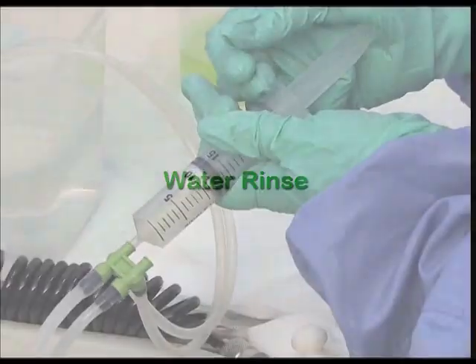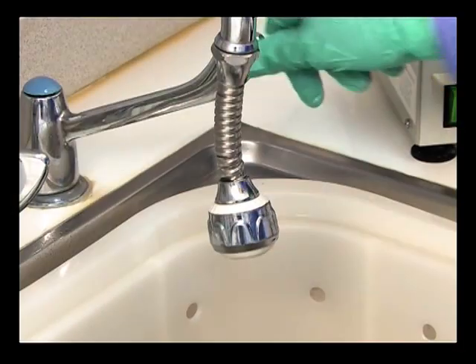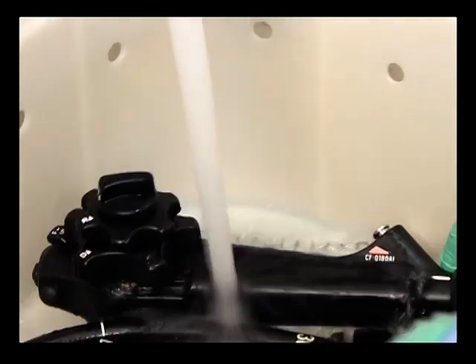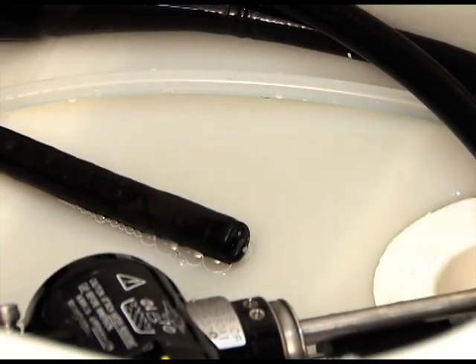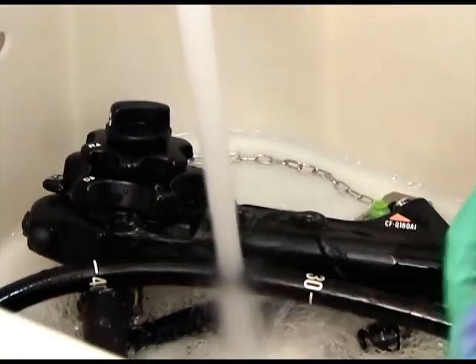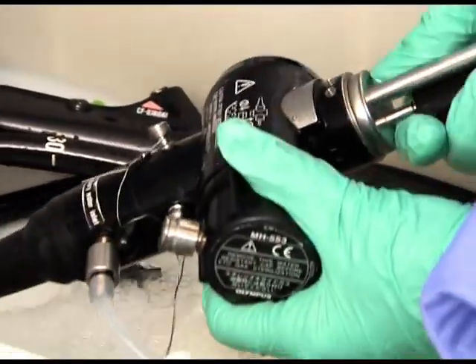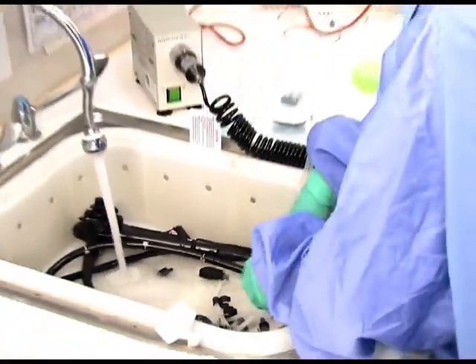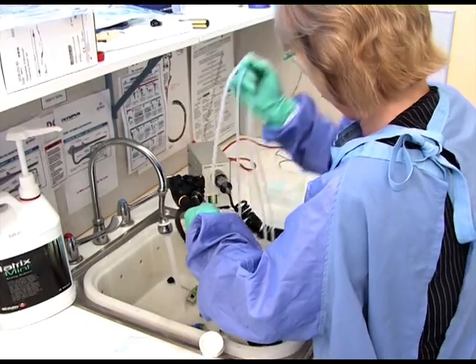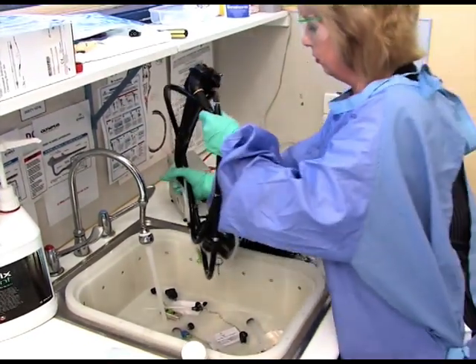Flush all channels thoroughly with clean water to remove any enzymatic or biofilm remover. Rinse the outer surfaces of the endoscope with clean, running water to remove all traces of detergent prior to disinfection. Purge water from all channels with air to remove rinsing water prior to disinfection. Remove attachments where necessary in preparation for automated reprocessing; these may not be removed if manual soaking is the method of disinfection. Removing water prevents dilution of the biocide used for disinfection. The use of clean water for each endoscope limits the potential for cross-infection.